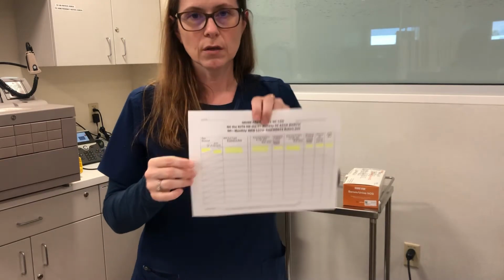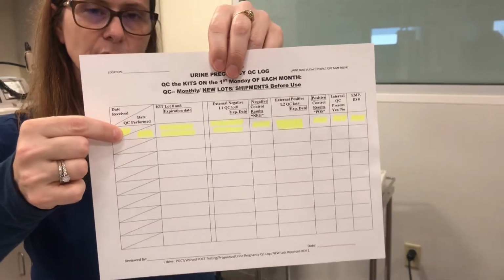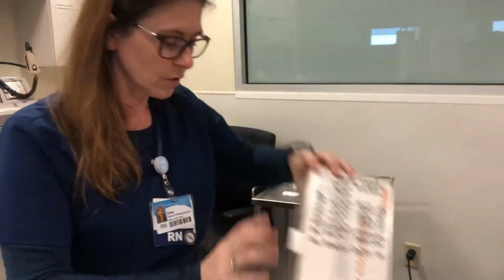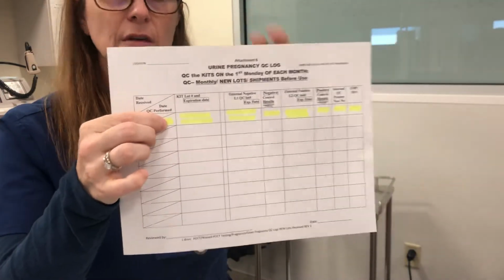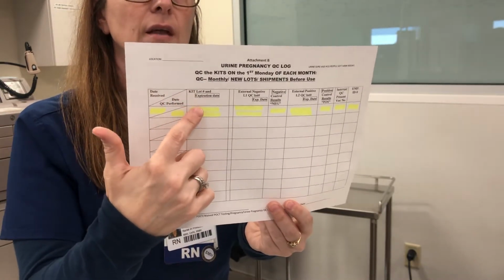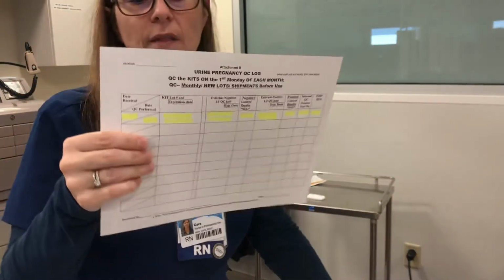But what you do need to complete, and I'm going to try to hold this up, so you're going to write the date that you received the kit, and it's up here. If you look at the box, the very first date that's recorded is the date it was received. So that date would go first in the first column. The second date is going to be the date that you QC'd it, so that would be today, May 6th. Then you're going to write the kit lot number, which is located on the kit box where it says lot number.